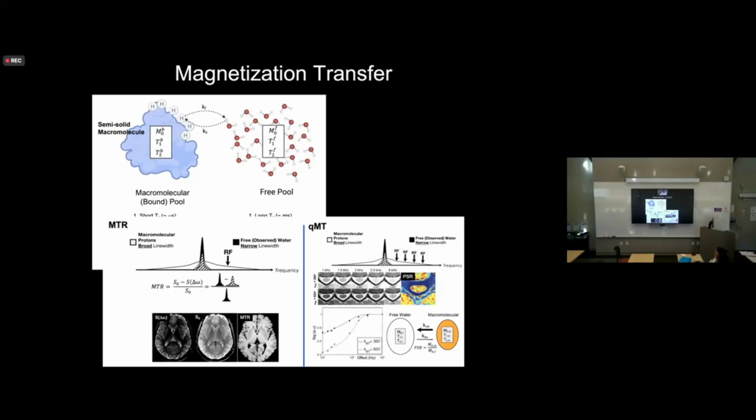While all of those are true, there have certainly been quite a bit of advancements over the past 20 or 30 years that allow this to be more feasible or more approachable in the spinal cord. And what quantitative magnetization transfer does is, rather than just saturating and not saturating, the idea is to take a bunch of images where we saturate at different frequencies, apply the model, fit to the model, and then try to back out things like the pool size ratio, which is a reflection of the macromolecular content of the tissue.